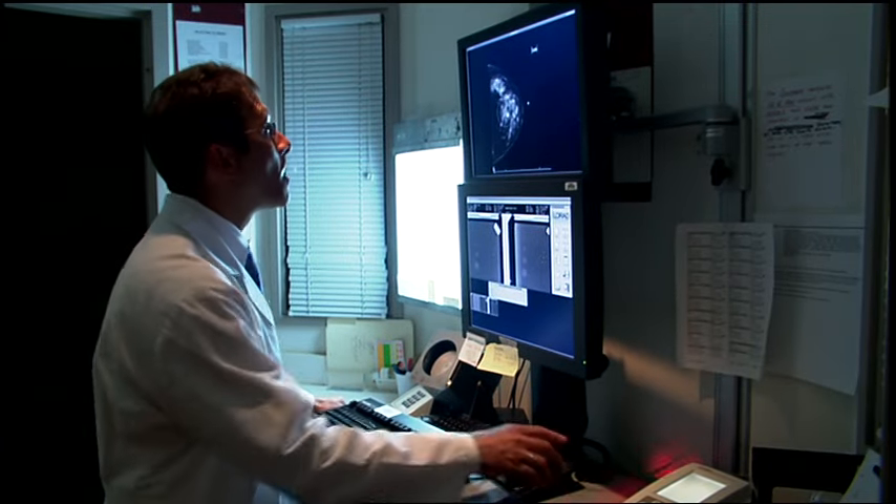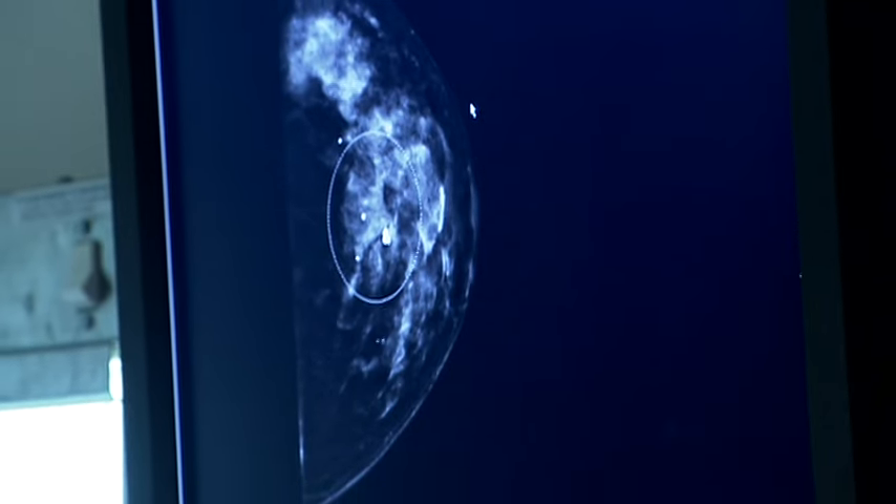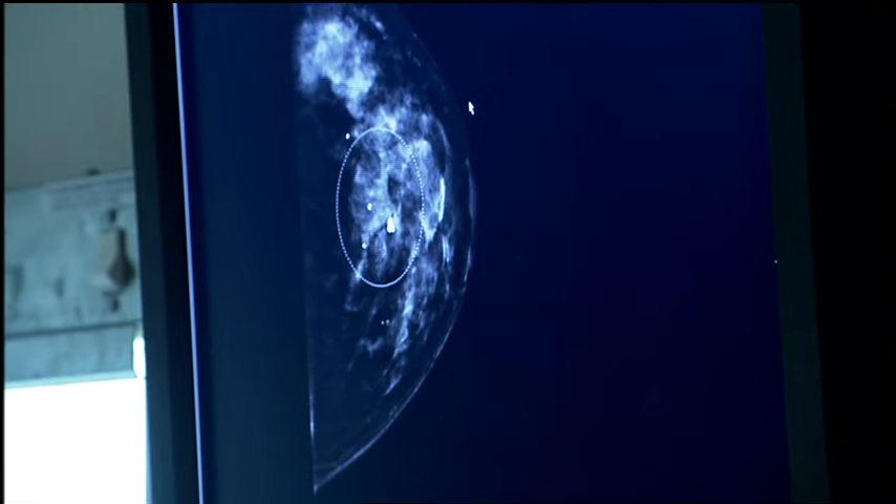Stereotactic biopsy uses computer technology to pinpoint extremely small masses or calcifications for biopsy. A physician explains the procedure and asks for the patient's consent before proceeding.